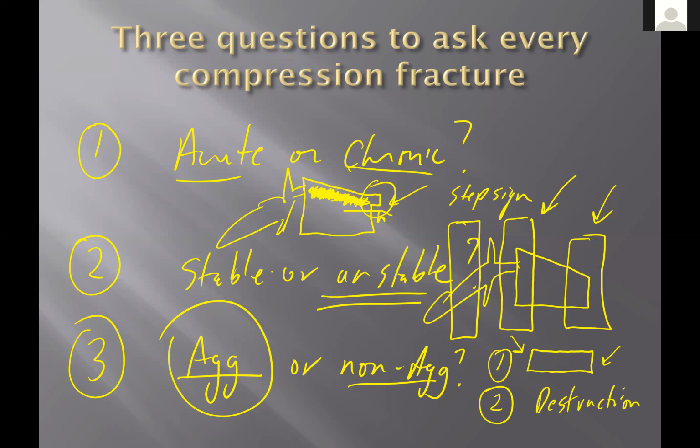One additional question, doctor. Yes. How common is it for you to see non-pathological fractures that manifest themselves with a reduction of the posterior aspect of the vertebral body height? I've probably seen it 7 times in 20 years, but I'm looking at everybody's films. Okay. So it's not extremely common. More commonly, you'll see loss of anterior and posterior vertebral body height in the context of osteoporosis.